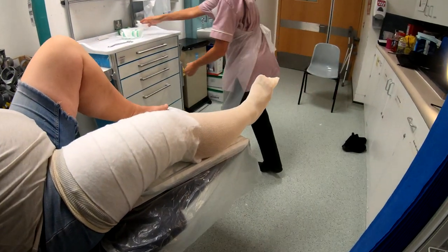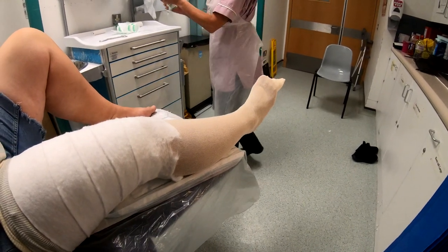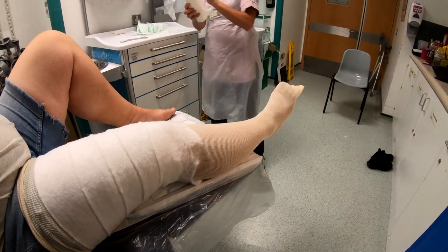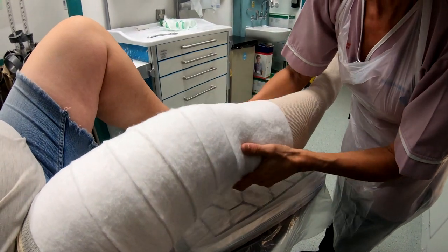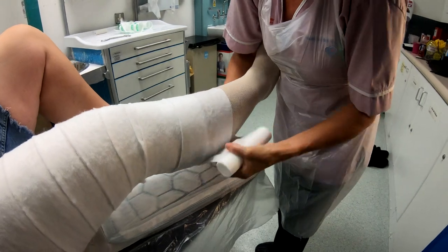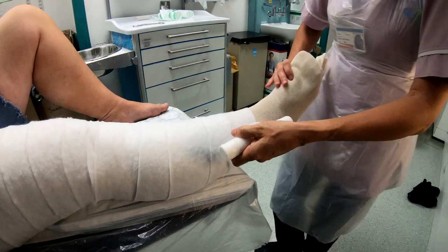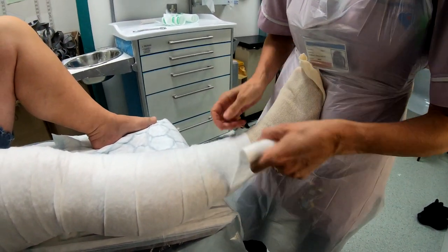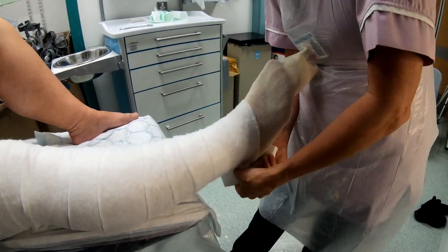Just going to get another roll. We always take the little edges off so it conforms nicely and sticks to the one you've already got there. And we work our way down the whole leg. As you approach the ankle, keep it to 90 degrees so it doesn't all shrivel up around the ankle and cause any irritation.